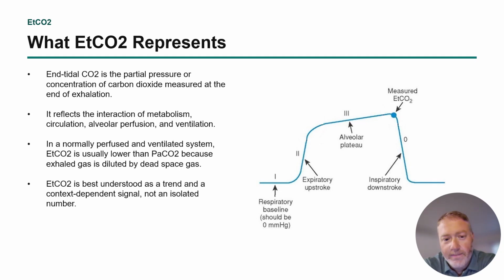So as soon as you hook it up, and as soon as you get a good pleth, take a look at the number, and then watch that number as it changes over time en route. So if there's a quick escalation, then you know that you are having some CO2 retention, and you can troubleshoot that way, and then vice versa.